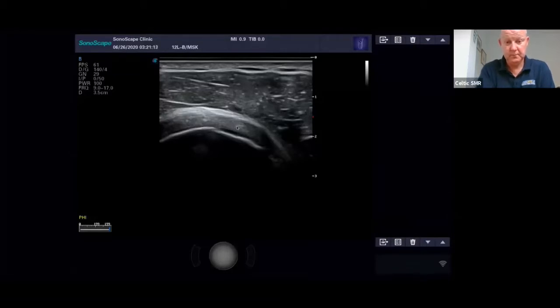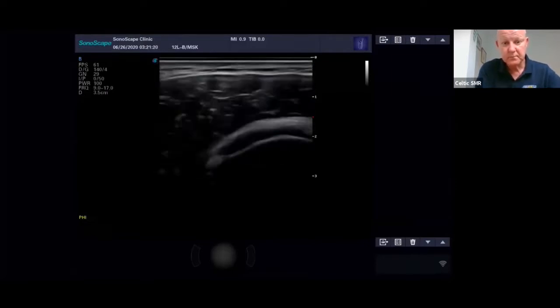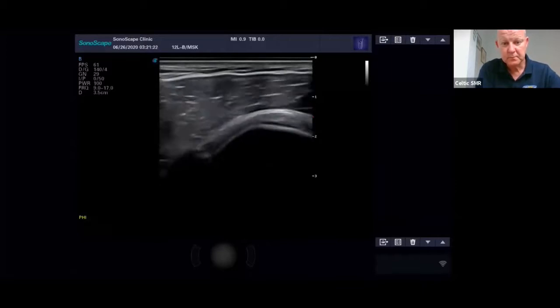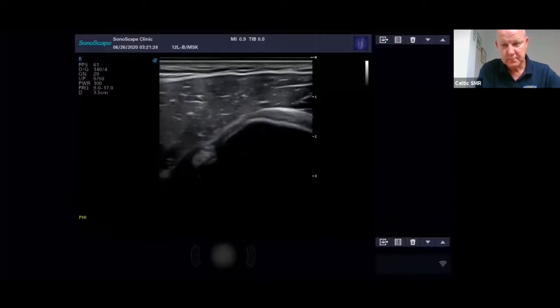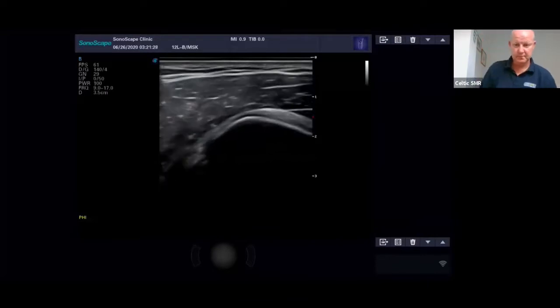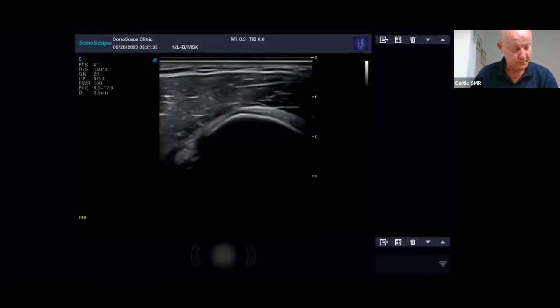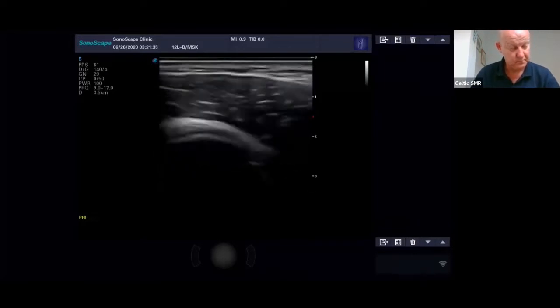And then if I go back to a long section, oh, and there you can see what I've done is I've put the probe the other way around. So you see how it's flipped the image? The biceps tendon is now on the left. That doesn't work for me because when I move the probe one way, the tendon goes the other way. So I need to correct that.